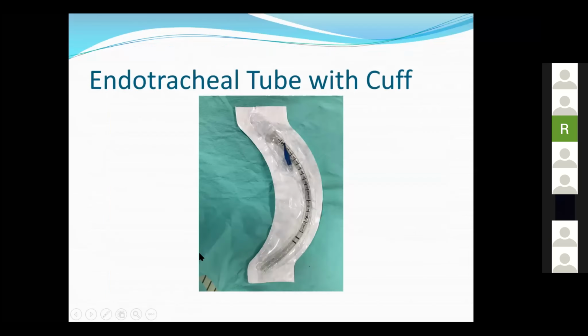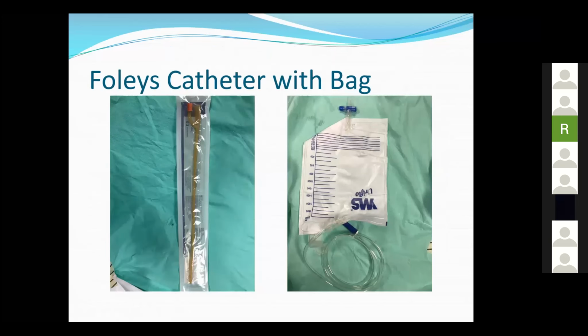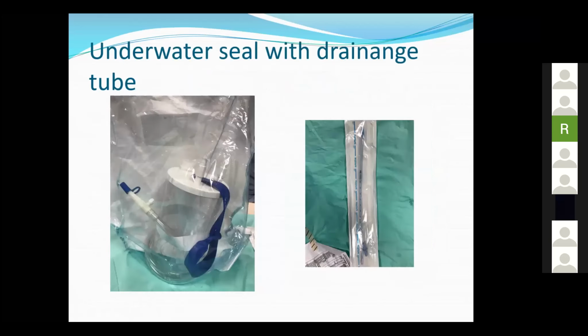There is another bottle which you can collapse, a silicone one, and if it is collapsed, it has a negative pressure. If there is no negative pressure and this green thing pops off, then probably the negative pressure is gone. It is like a gravity drain. So you have to change the bottle so that there is a negative pressure and the purpose is served.